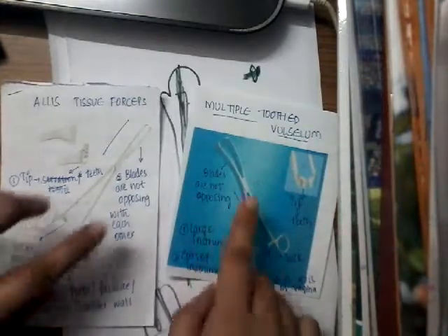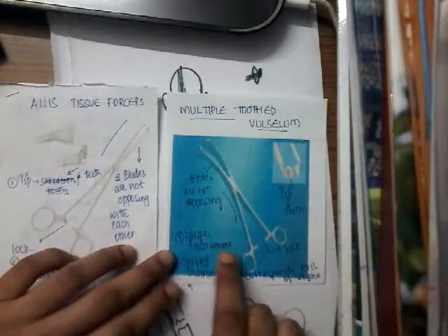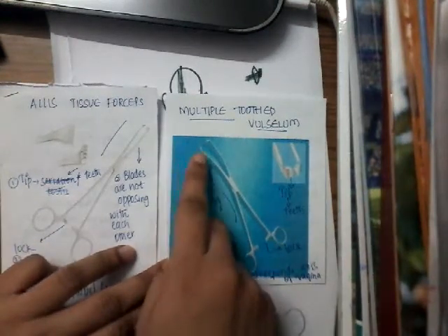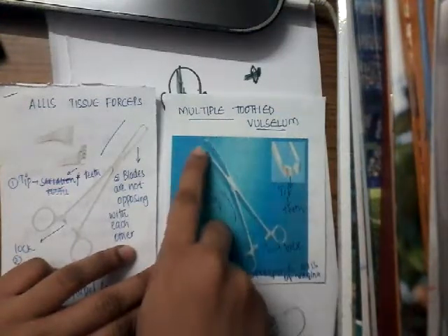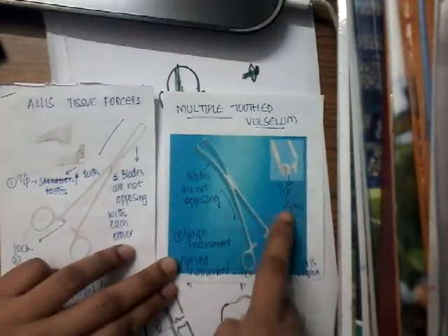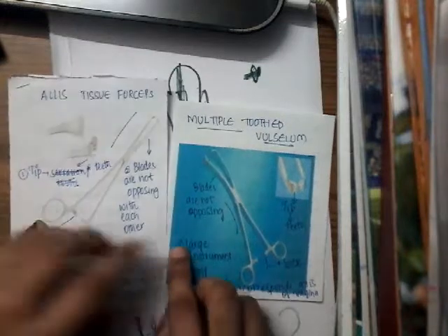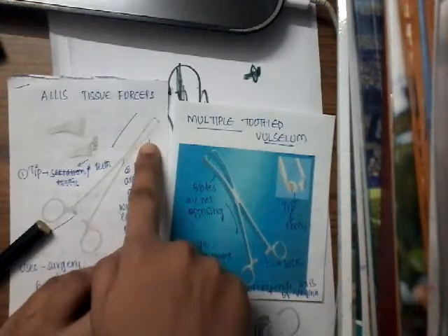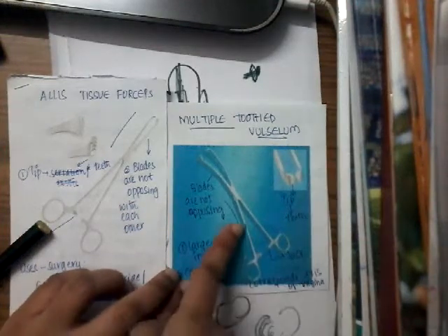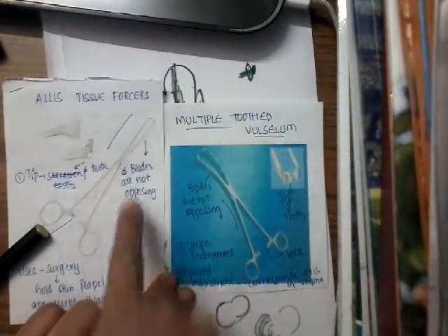This is the multiple tooth valsellum and this is Alice forceps. If you see both, they have a lock. Looking at the ends — the tips and blades — they have teeth; the tip has many teeth. The only difference is that the blades are not opposing in either instrument, but the multiple tooth valsellum is a little curved, whereas Alice forceps is not curved.